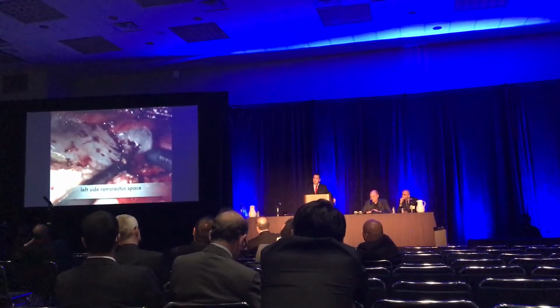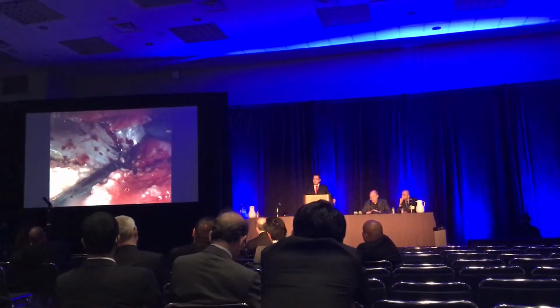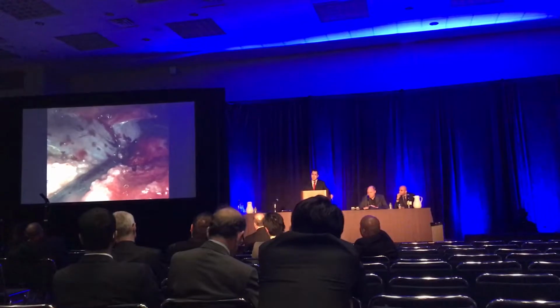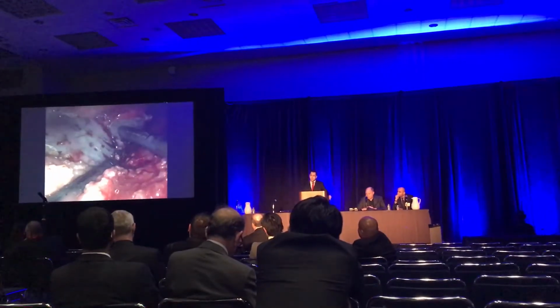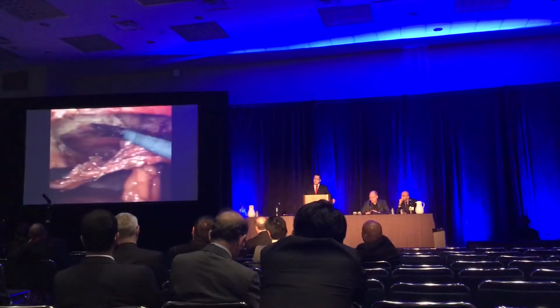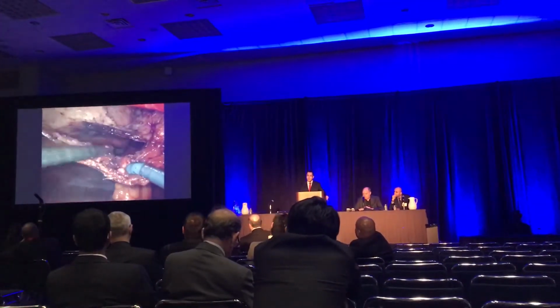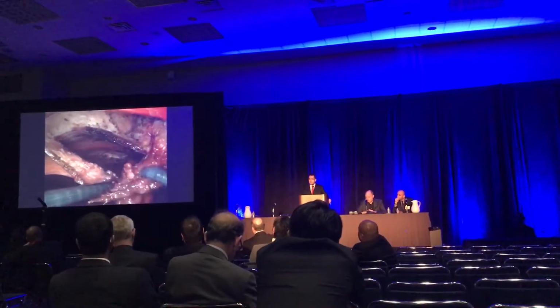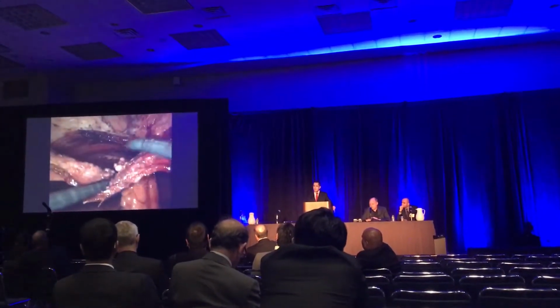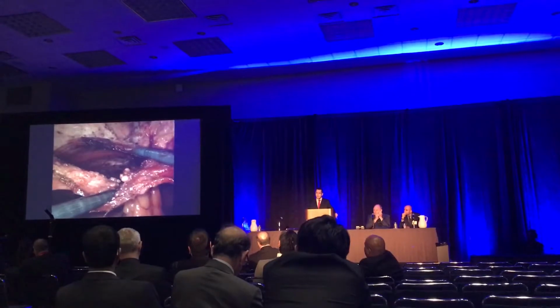Now the surgeon has crossed to the left side retrorectus space, and the dissection on this side is completely similar to the one performed before. Here you can see the separation of the rectus muscle and the hernia, the parastomal hernia. Both defects will be closed.